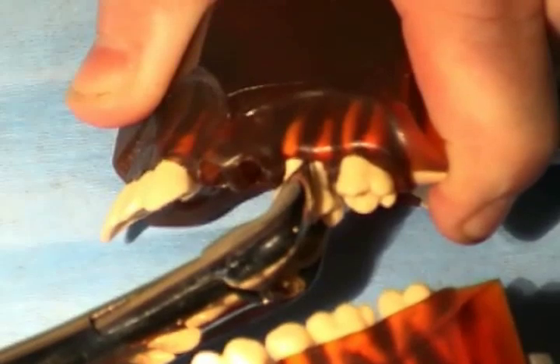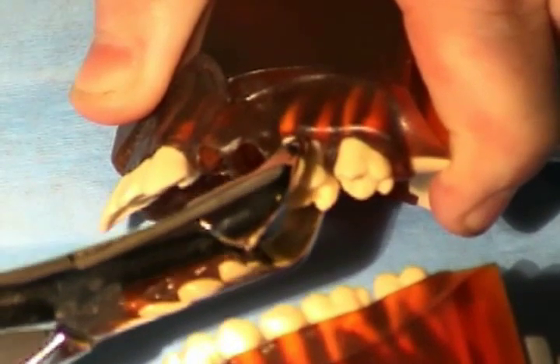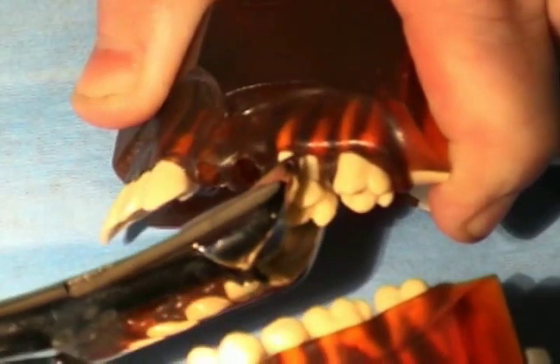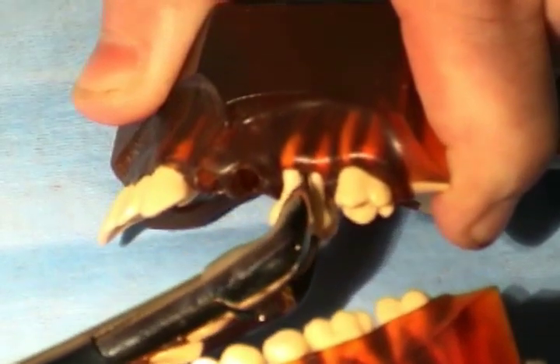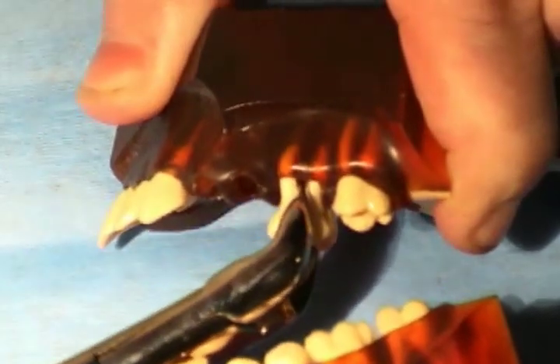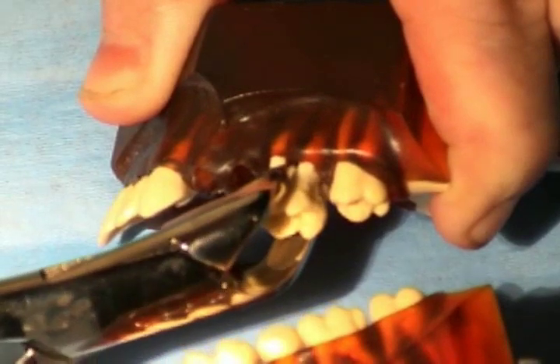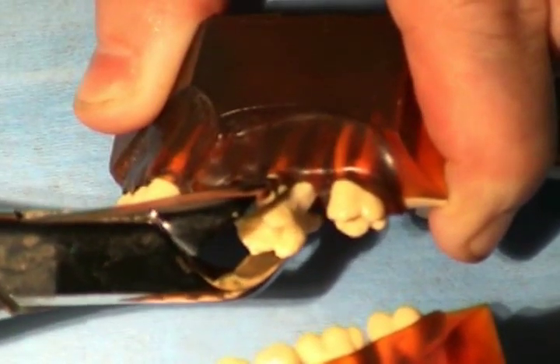A slightly different design of the lingual part of the forceps can be seen in the instruments called 88R and 88L. The technique of extraction with a cowhorn can be the same as with other forceps, but in addition, especially in the lower jaw, it can be useful to squeeze the handles, during which vertical extraction force is applied as a result of the forceps pushing away from the crestal bone.